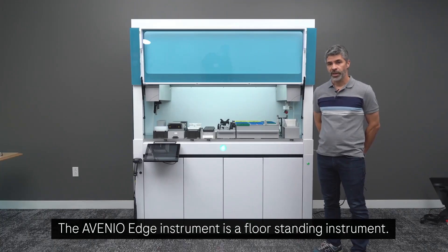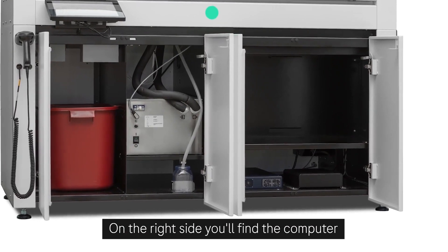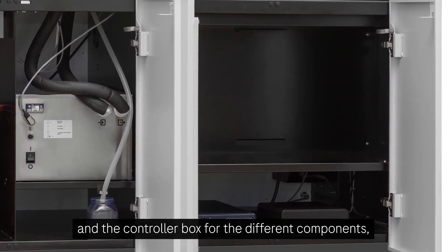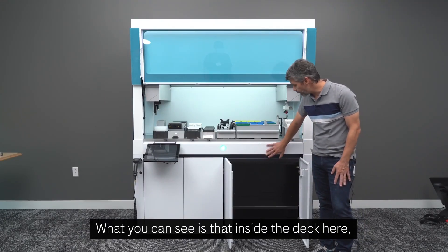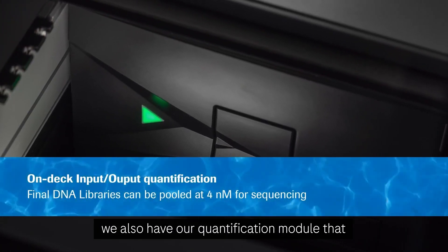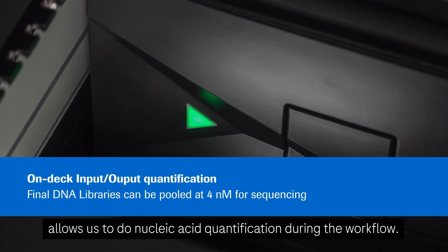The AVENIO Edge instrument is a floor standing instrument. On the right side, you'll find the computer and the controller box for the different components, and also some storage area. What you can see is that inside the deck here, we also have our quantification module that allows us to do nucleic acid quantification during the workflow.